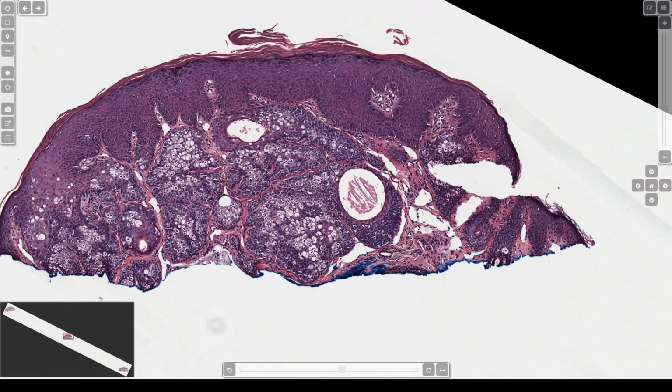There's not very many options in the sebaceous family. Unfortunately, sometimes sorting out which option can be challenging, even though there's not a lot of options. The main options are sebaceous hyperplasia, right? Which is basically big, huge, very mature looking sebaceous glands, very white appearance, okay? And then there's sebaceous adenoma and sebaceoma, which to me are on a spectrum and is just splitting of, not splitting of hairs, splitting of sebaceous glands, I guess.